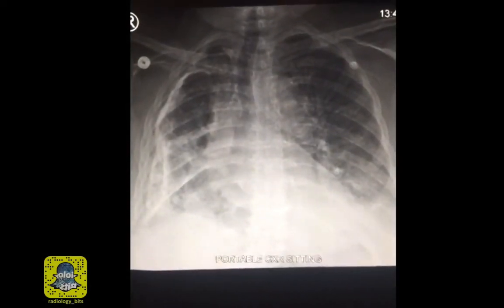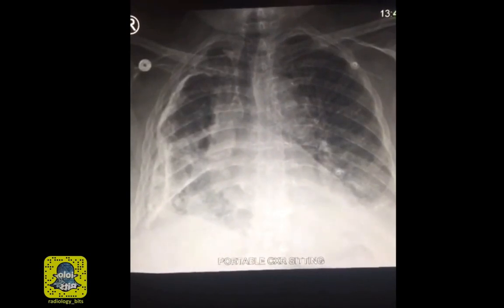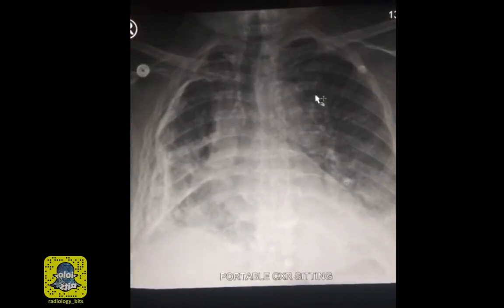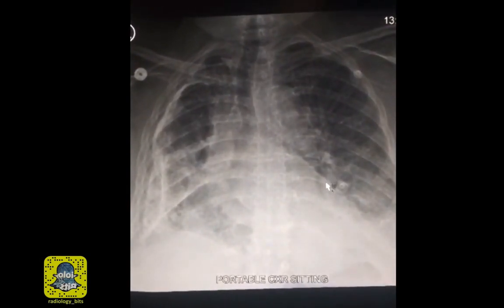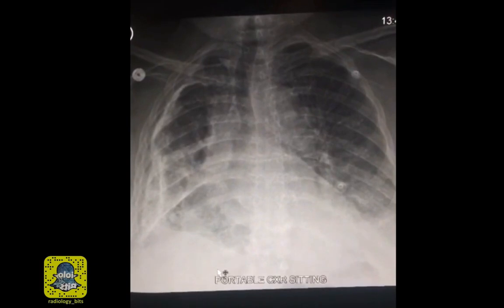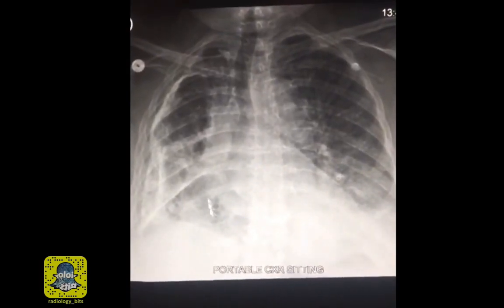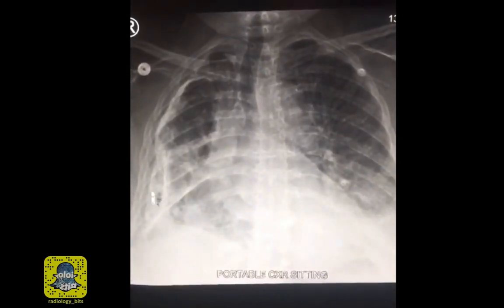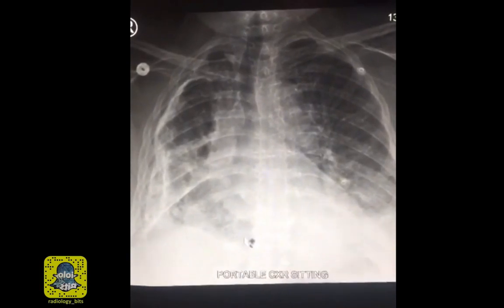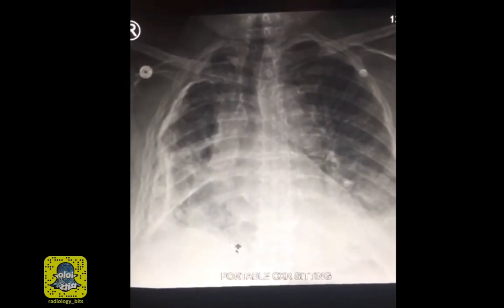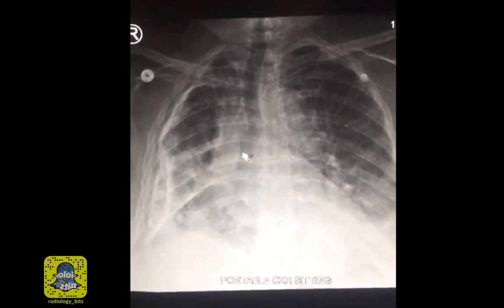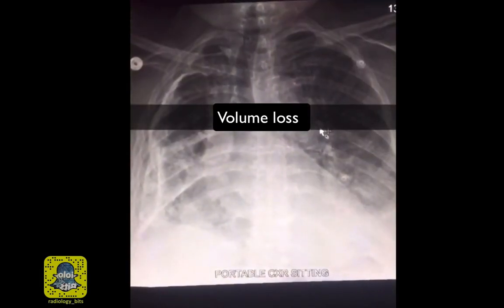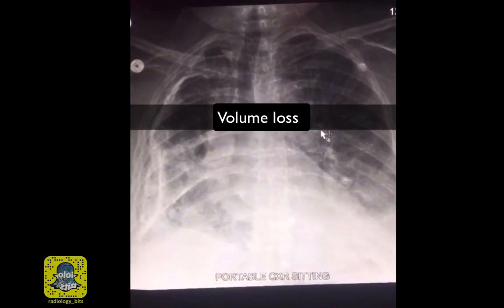Hi again. This is a quick case that's good to show to both seniors and juniors. This is a portable sitting chest X-ray on a patient who's known to have cardiac disease. The reason I'm showing you the case is to look at this unusual appearance of the right hemithorax. The right hemithorax is small in size compared to the left hemithorax, so there is some degree of volume loss.